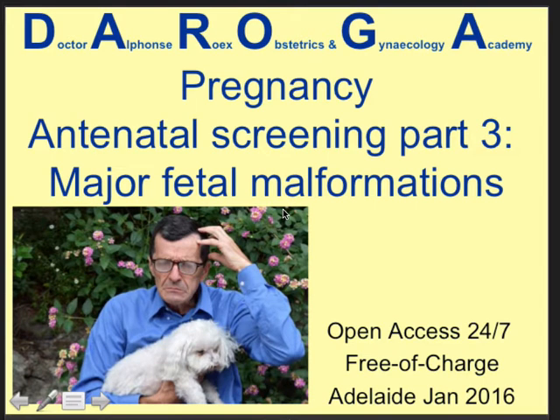This is part 3, antenatal screening. Today we present the morphology scan with a focus on major fetal malformations.